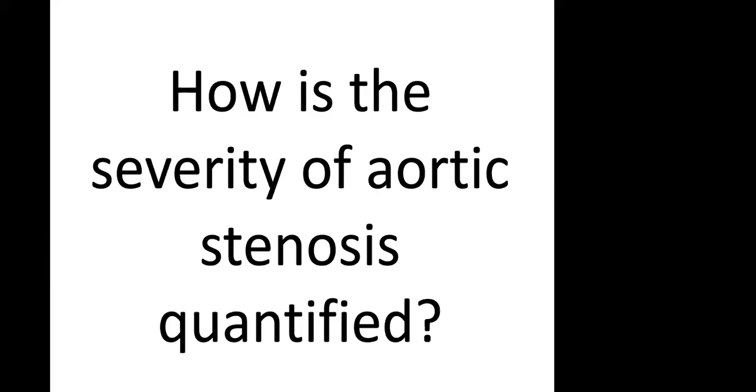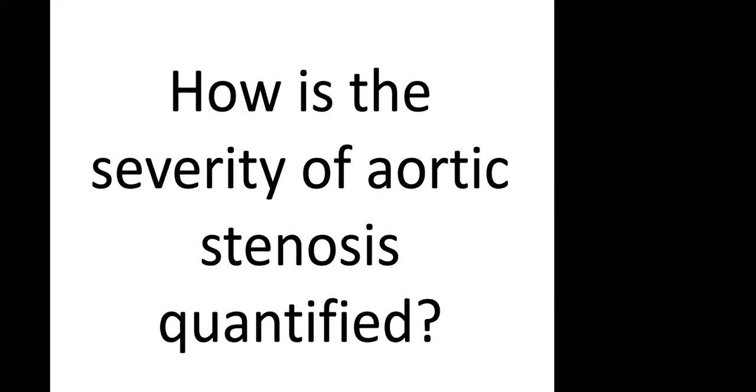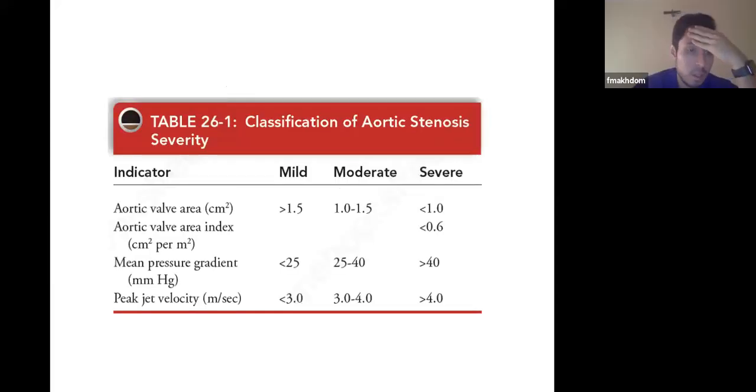Calcium score, this is with a different modality, which is CT scan, if you're in doubt. Yeah, peak velocity, area, gradient. Half time is for AI, to quantify AI. And the burden of the calcium, the calcium quantification, if you want numbers, is by CT scan, not by echo. Yeah, by CT. Okay, that's good.